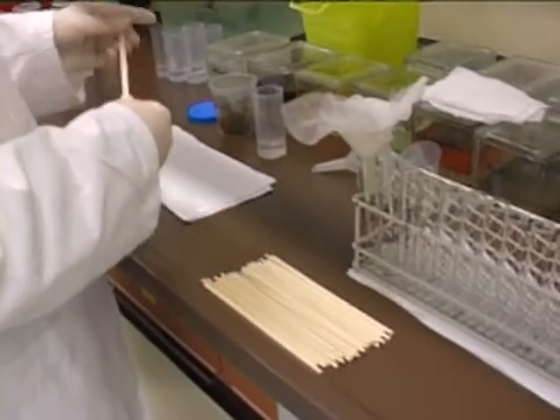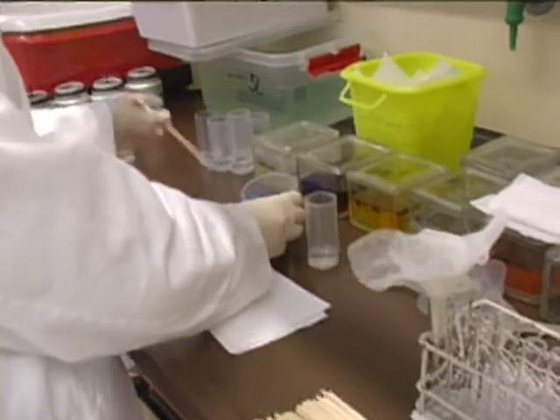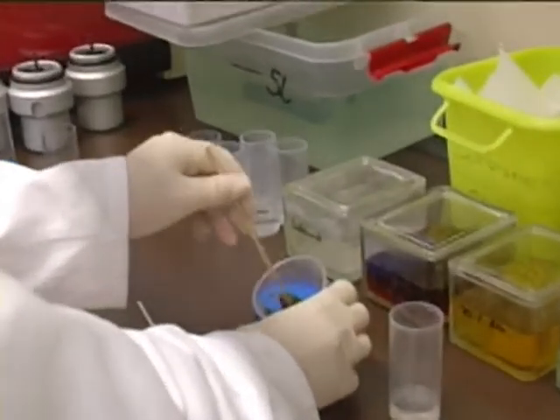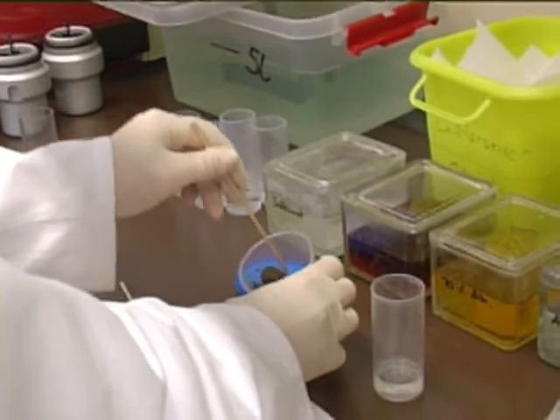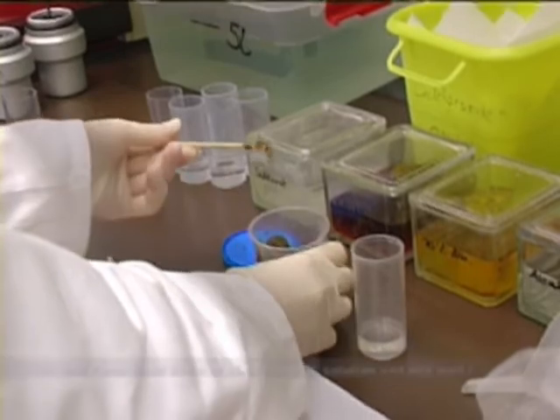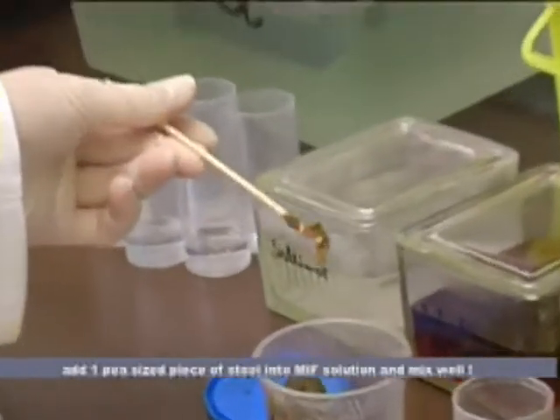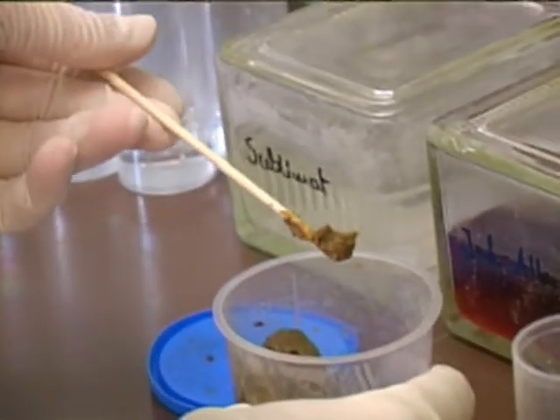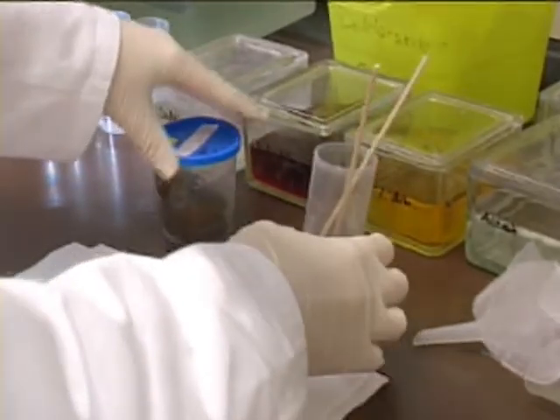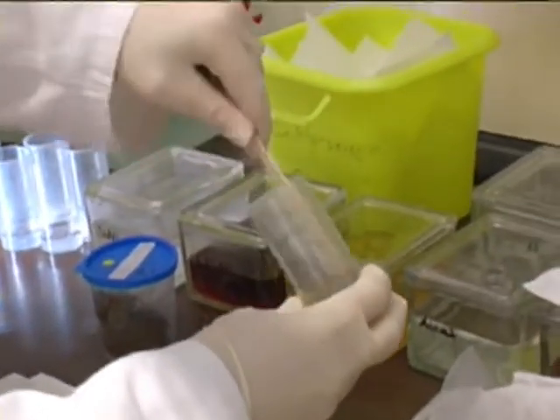We take two of the wood sticks. Ich weiß nicht, wie viel man das sagen kann, grammmäßig. Maybe like a pea. Just as much as a pea. It goes into the MIF solution. Mix it well.